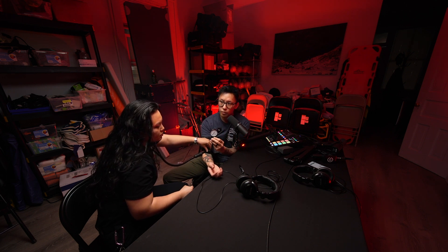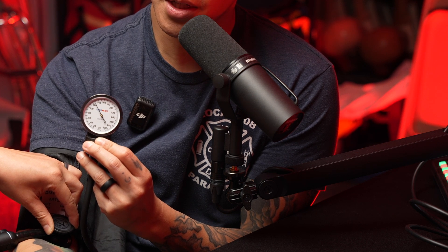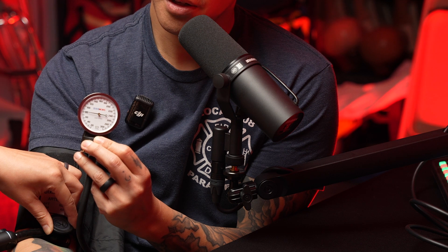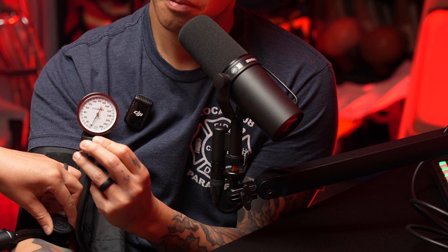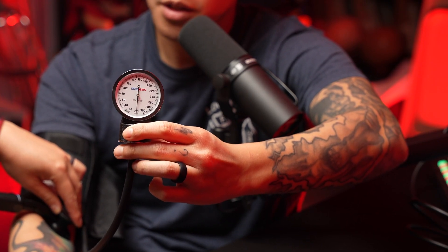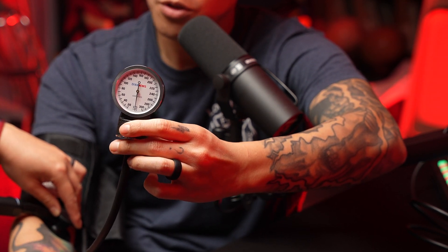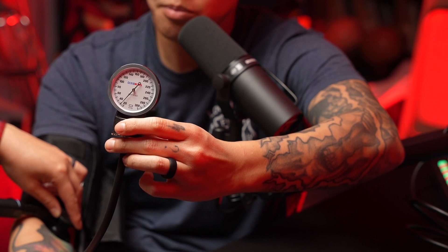When you're slowly deflating that cuff, you see this ticker going down, and you're eventually going to hear it again. After you first hear it, you're going to continue hearing it — it's going to sound like a heartbeat: beat, beat, beat, beat. It's going to eventually disappear because that turbulent blood flow is no longer turbulent — it becomes laminar blood flow. The moment you first heard it is the first number, and the moment it disappears is the second number.